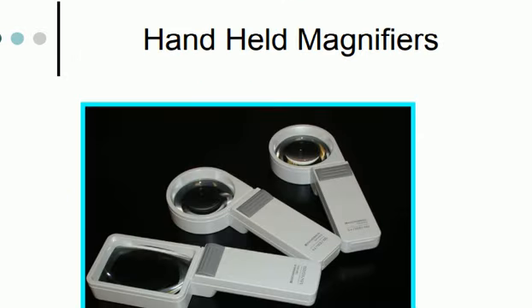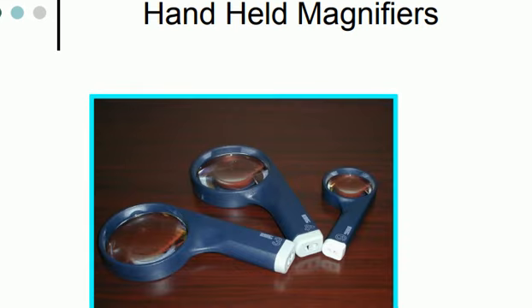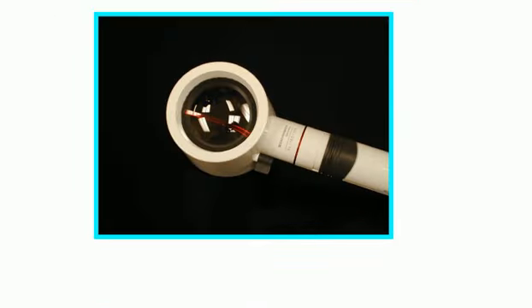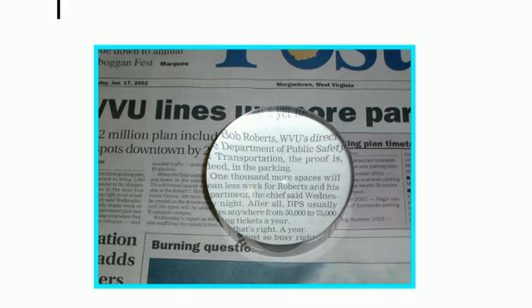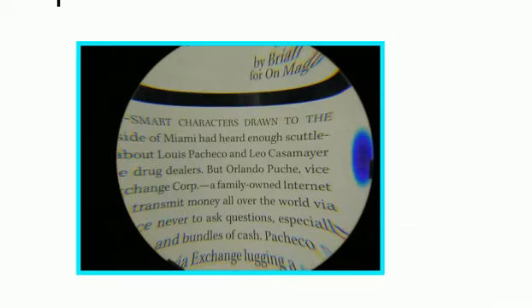These are handheld magnifiers. These are also handheld magnifiers, convex lenses. These are also handheld magnifiers. These are stand magnifiers. These are also stand magnifiers.